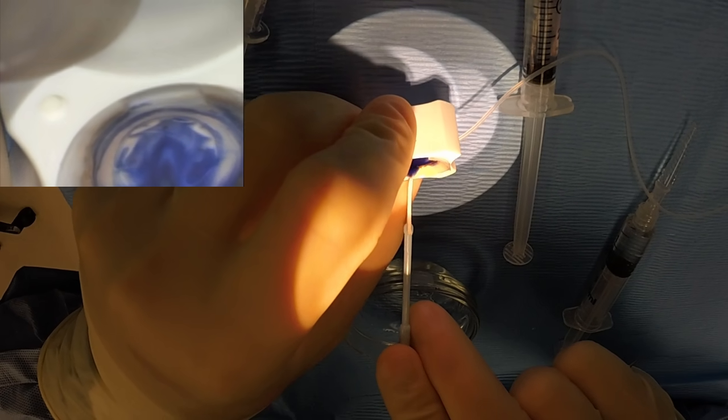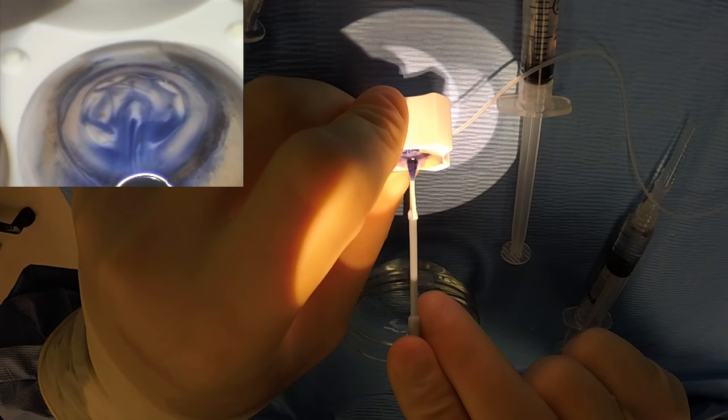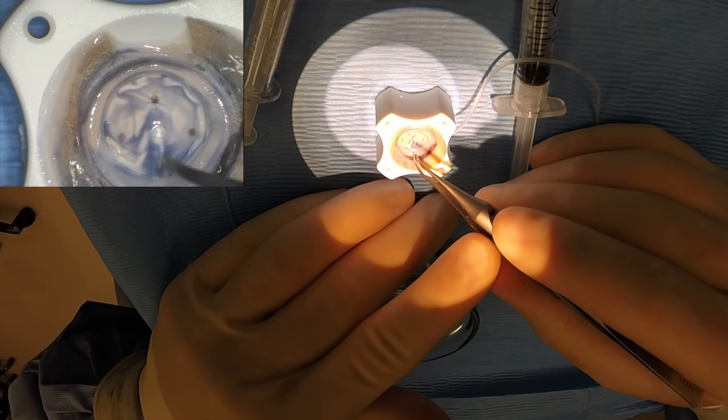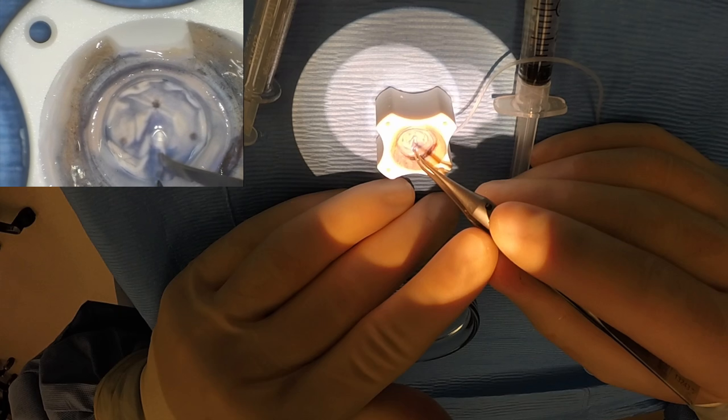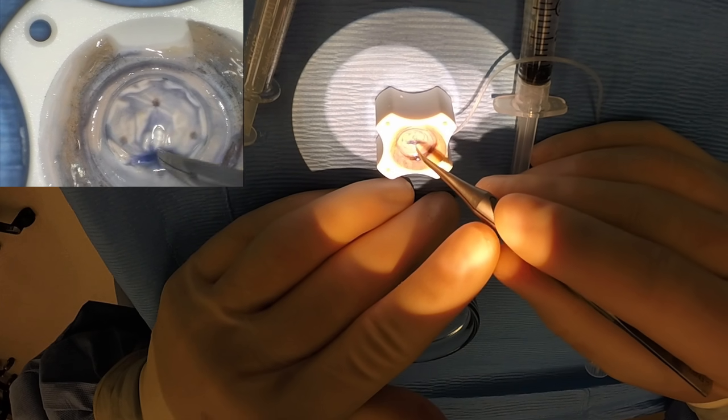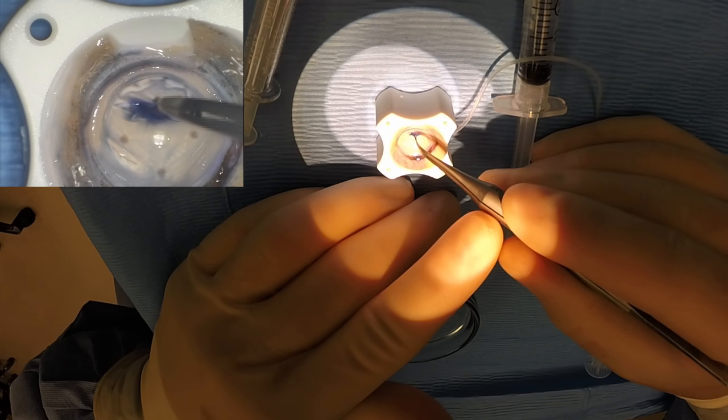Remove some of the excess tri-pan there. Then I use curved forceps from Moria, a very delicate tip, and try to just grab in one spot and pick it straight up toward the hinge.